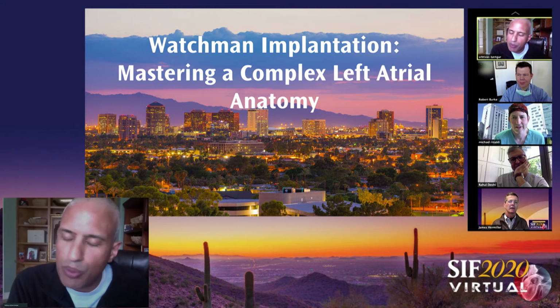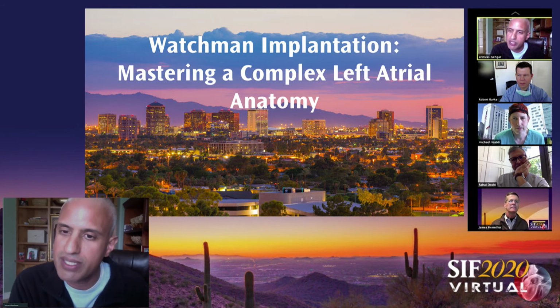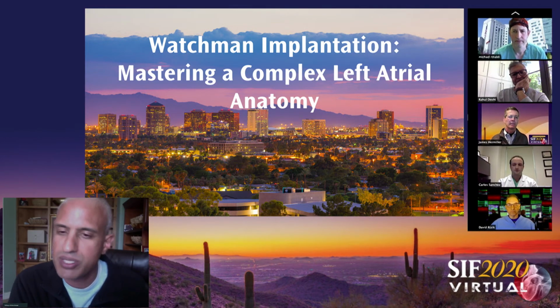And Mike, that's a great point. I tend to be very communicative with my lab staff, and I told them, listen, if this doesn't work, we're walking away. We're not forcing something in. We're not trying to force it in the hoop. If it doesn't go, walk away. We have an atrial clip program with our surgeons. They're very good at it. And again, I just feel like sometimes we tend to, as proceduralists, force the issue. And I think you can get yourself into trouble by doing that.